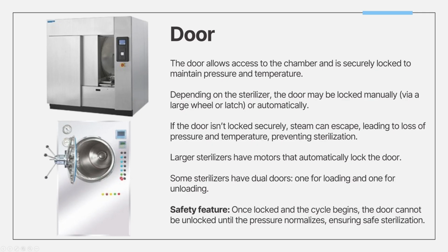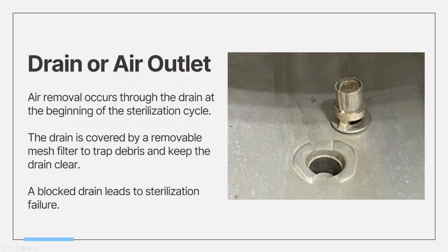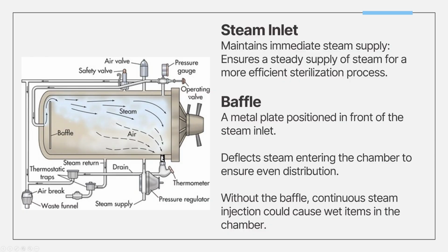And I'll show you a picture here. Yeah, so the drain is right here, if you could see it properly. It's typically placed here at the front of any sterilizer. Yeah, this is the front, this is the door, this is the drain.